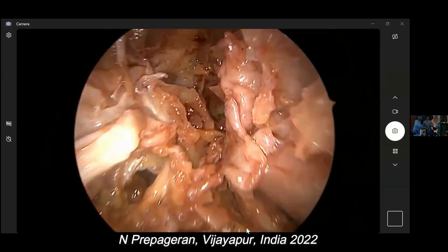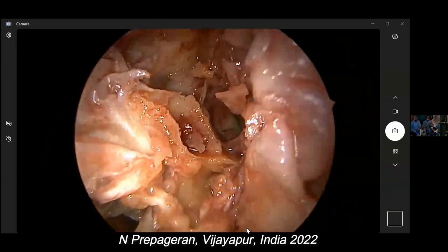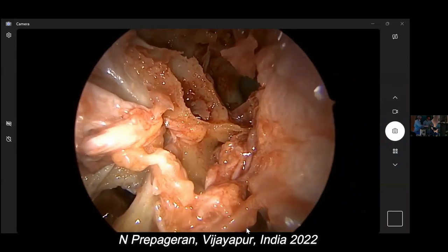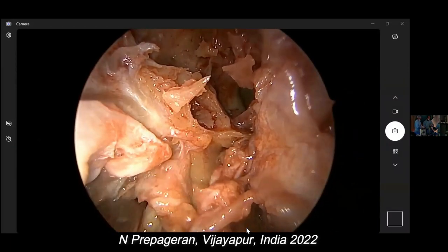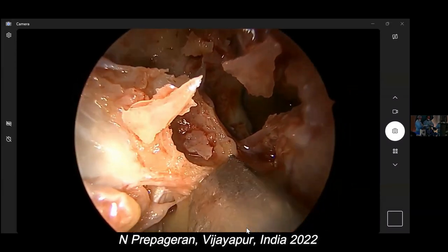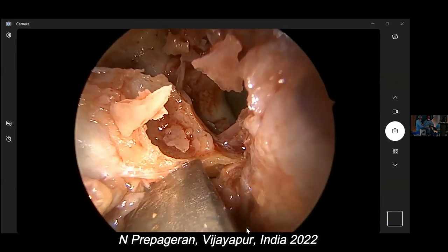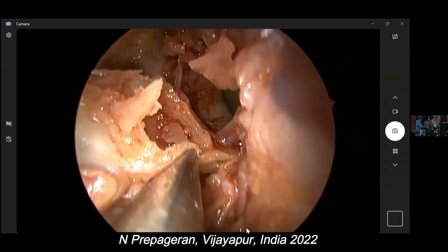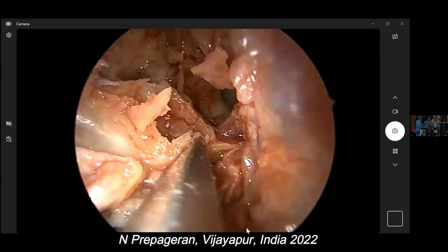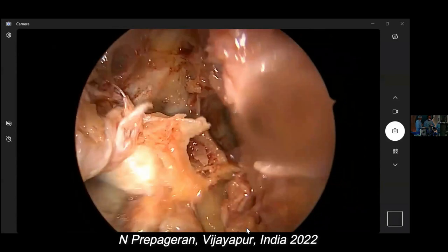So what I'm going to do now... See, unfortunately, this bone is a very hard bone. So I'm not sure whether I'll be able to show you microscale. I'll try. So this is V2, correct? Beautiful. Rotundum. Okay. Let's find... Ah, good. Lovely. I think we got it. So remove the bone here.